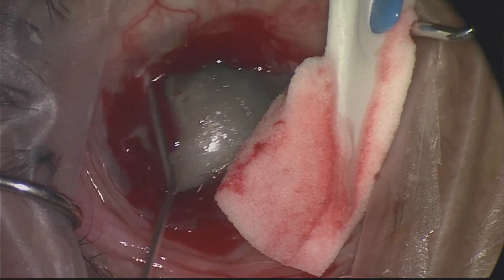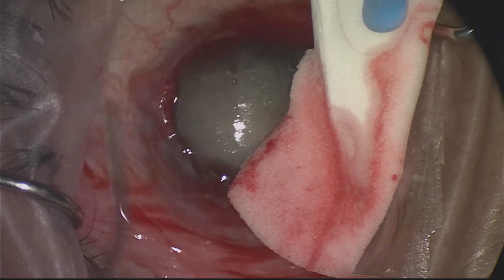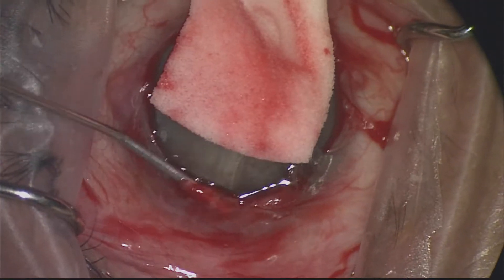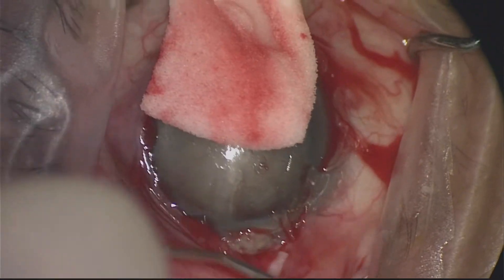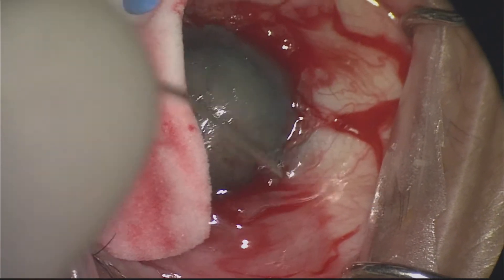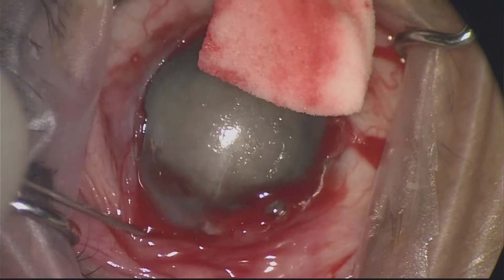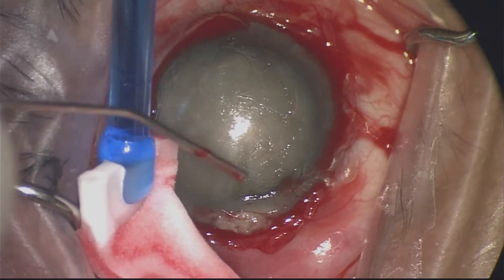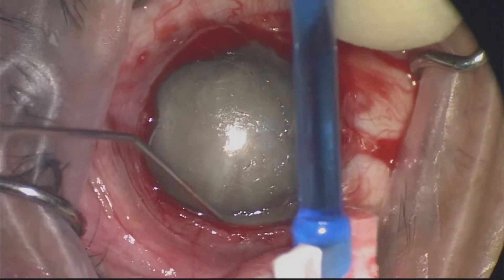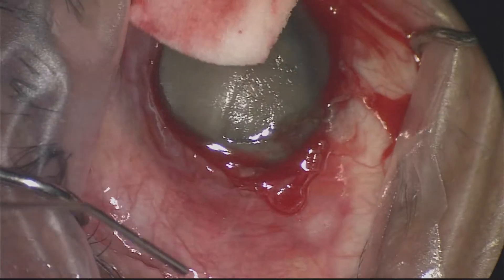Here I'm trying to find the plane again and lift the corneal scarring away. I'm very carefully avoiding going deeper because this level looks quite adequate and won't cause significant stromal scarring. There may be areas where Bowman's layer is compromised, so you have to be careful about the level and plane. You get a feel of how scarred the cornea is based on the plane you get and whether there's deeper scarring — you don't want to start digging too deep with your hydrodissection cannula.